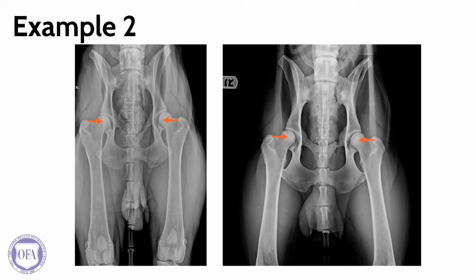While the radiographic technique is not ideal, and there is overexposure of the image, the positioning of the patient has improved and the coverage of the femoral heads is better able to be evaluated. Even such a small degree of rotation has resulted in a significant difference in grade for the dog, so it is important to really take the time to double-check that the positioning is optimal and to set the dog up for success.